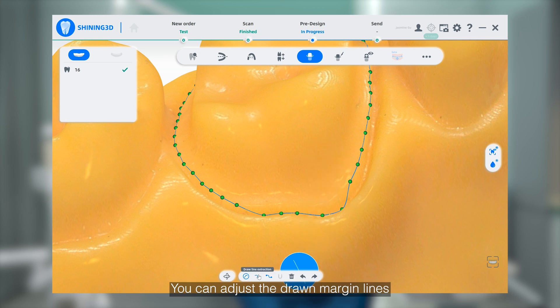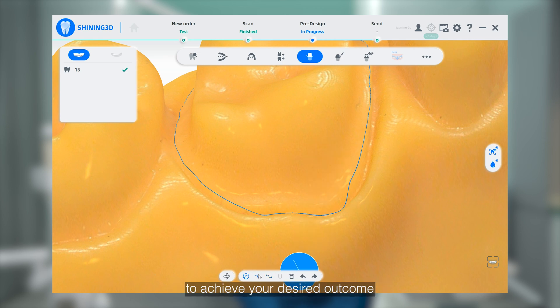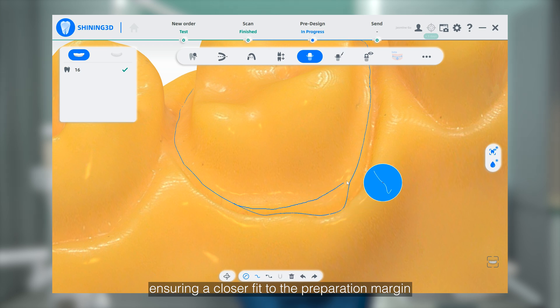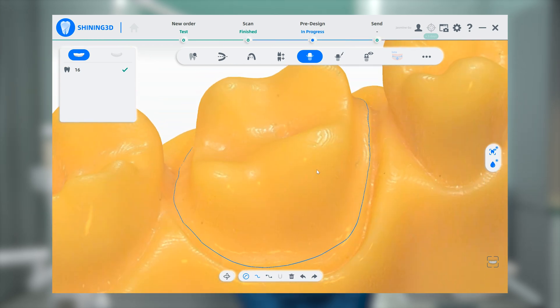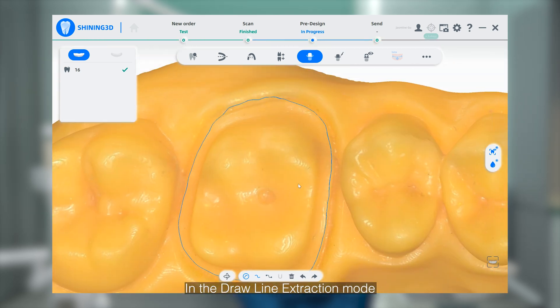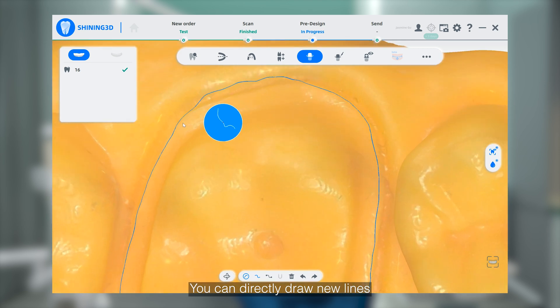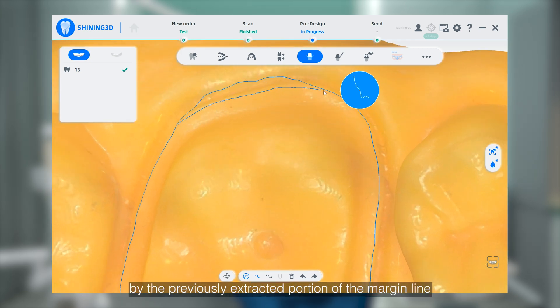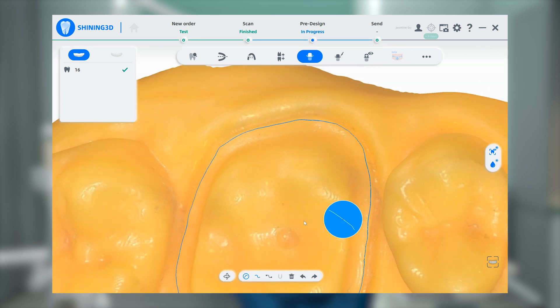You can adjust the drawn Marginal lines to achieve your desired outcome, ensuring a close fit to the preparation margin. In the draw-line extraction mode, you can directly draw new lines, and the new lines will seamlessly replace the previously extracted portion of the Marginal line.